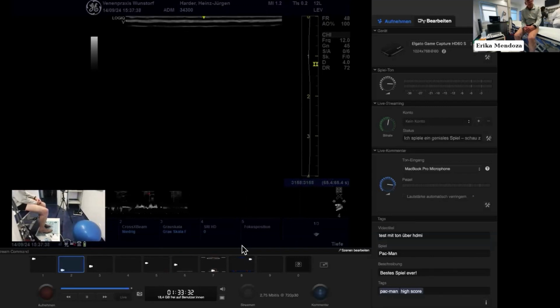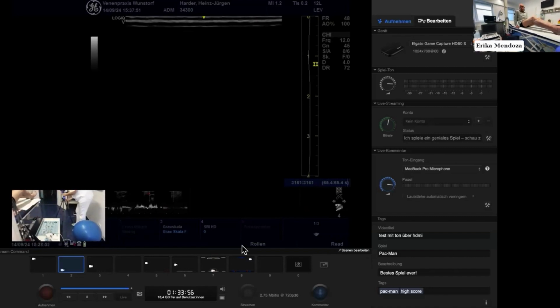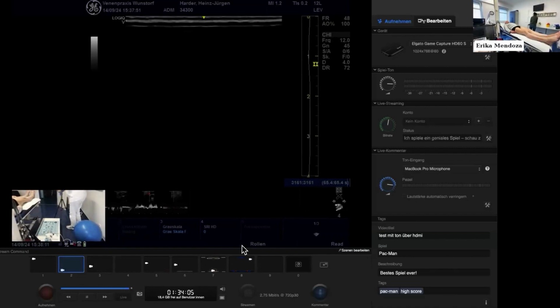And also, of course, we need to, by rights, monitor the patient. So you should at least be doing basic vitals, pulse, blood pressure, and oximetry, because occasionally you will get an intravascular bolus of adrenaline, even though at 1 in 2 million, that could be enough to cause a tachycardia, which is not a problem. But every now and then, if you're not careful, you will get either VT or even VF, and you've got to be there and ready to resuscitate the patient. So I think you need to make sure you've got a crash cart trolley and be ready.